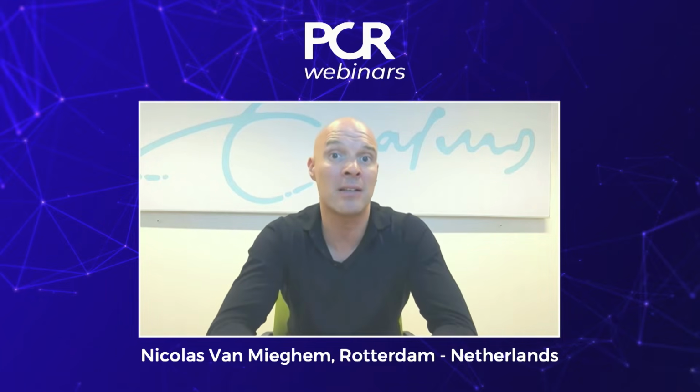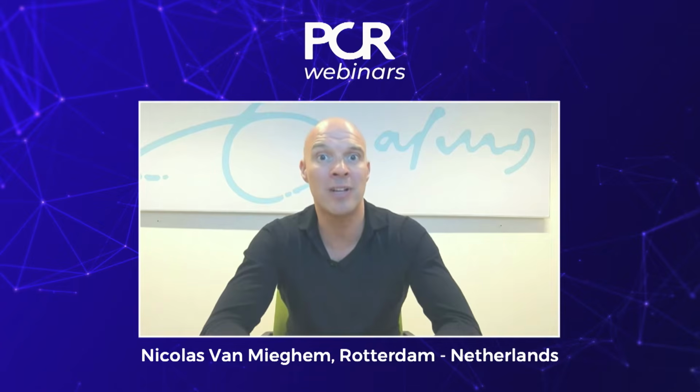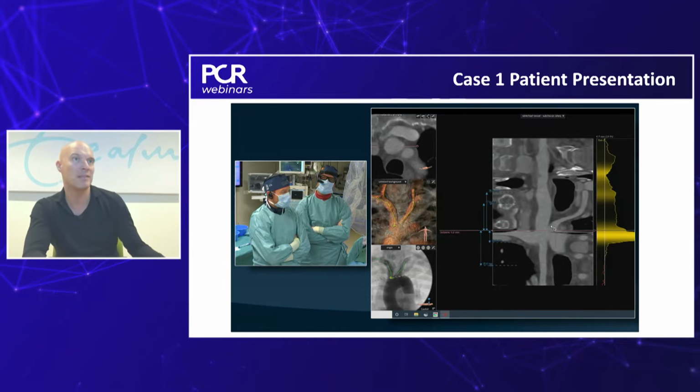Because you obviously want to avoid a suicide ventricle, you want to avoid a hemodynamic compromise because of the hypertrophic state, and maybe in a patient that is hypovolemic. This is definitely something to take into account, so volume management. But we'll get to that in the case. I think it's mandatory, especially in these patients, but maybe in a broader way in all the patients, to have a good hemodynamic assessment before and after the valve implant, just in order to manage the hemodynamic state of the patient. But with that, maybe we can continue with the case.